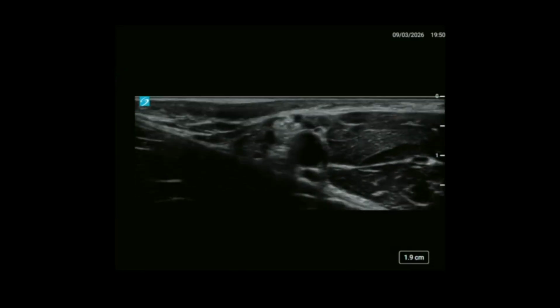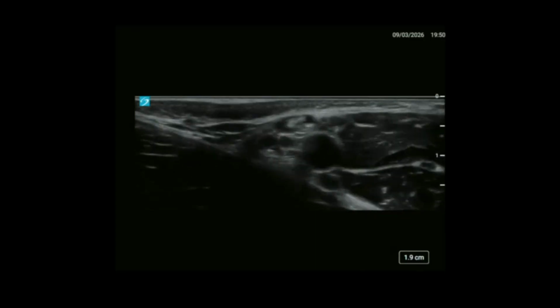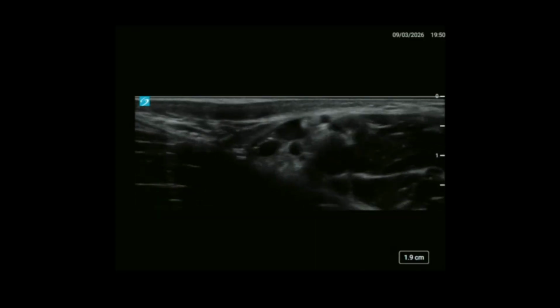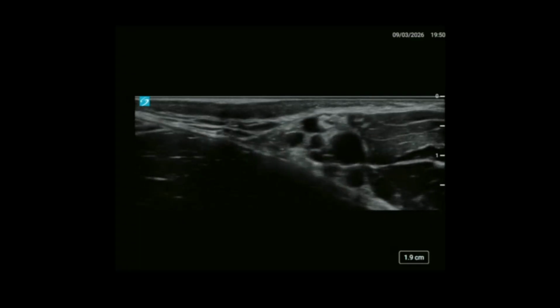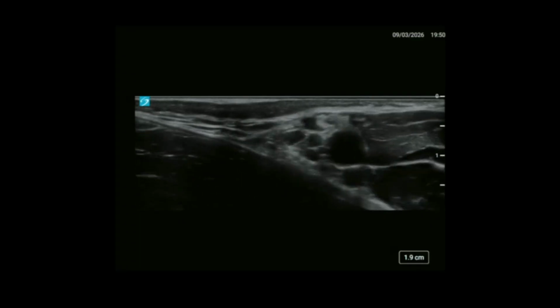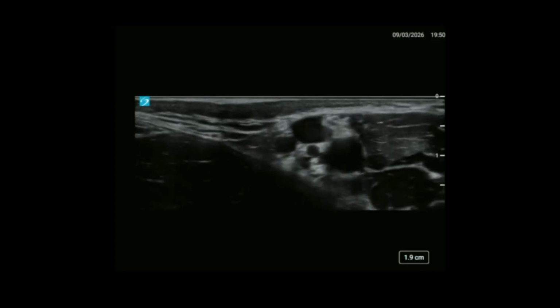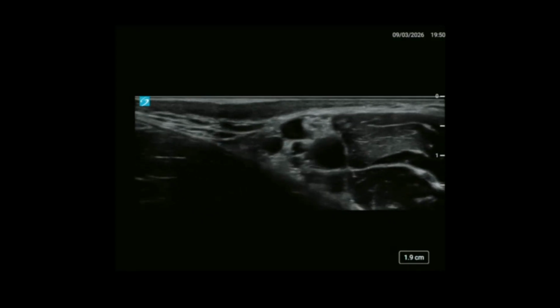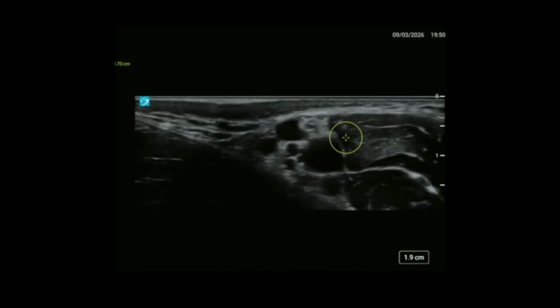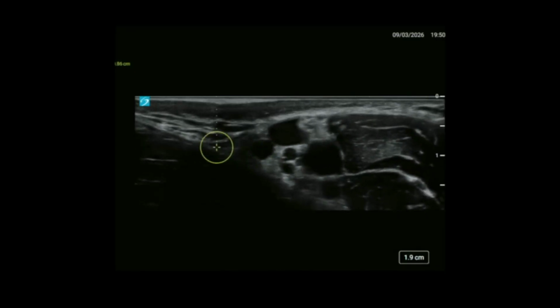There's a number of ways we can do that. It depends really on what we've opened up, the space we've opened up with our first passes around those other nerves. So potentially I might come between the median nerve and underneath the vein to get down here, over the top of the ulnar nerve. So my needle would sort of be coming through here and then up here.